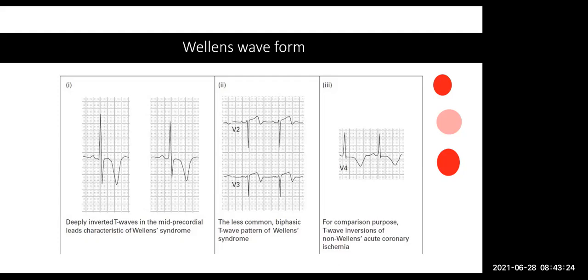Okay. Now, it seems like a strange concept. It seems like something you won't see very often. And it's true, it's not something you will see very often. You'll see it once every 2 years, maybe once every 3 years if you're working in an emergency department. I've seen it 3 times here. We've saved all 3 patients. They're all walking around, they're fine, they were stented. Everything is okay. But the important thing is to recognize it.